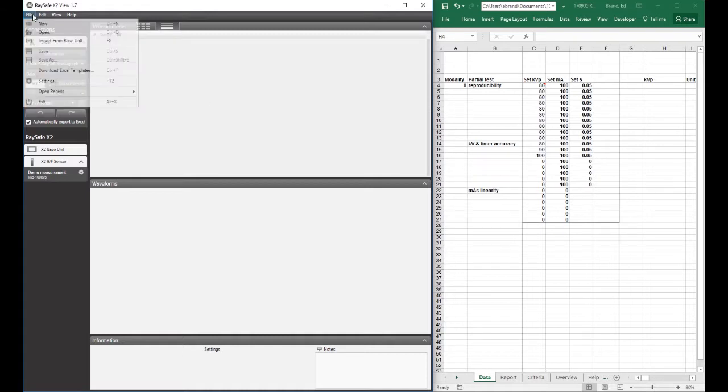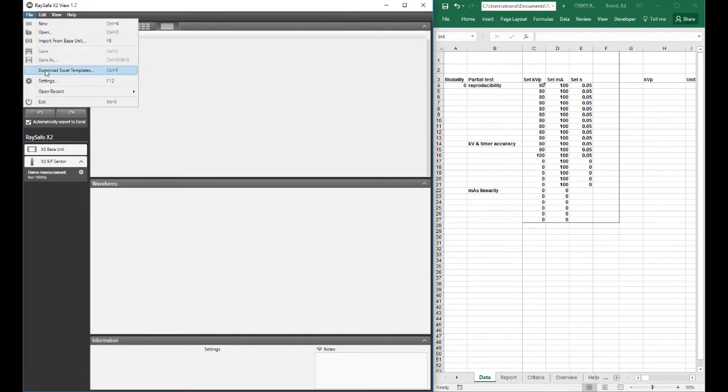Templates can be downloaded from our website, raysafe.com, or if you're in X2 View, this link, download Excel templates, will take you to the page on our website that allows you to download the templates.